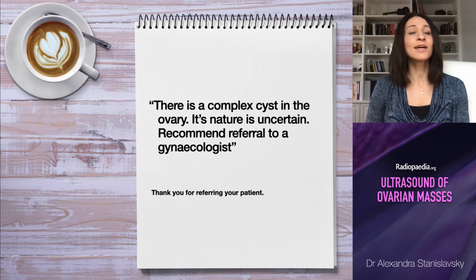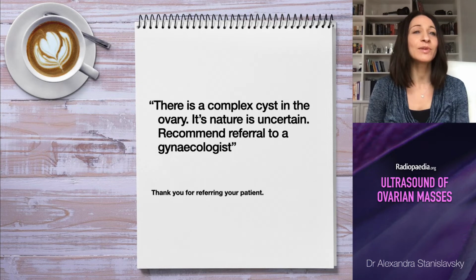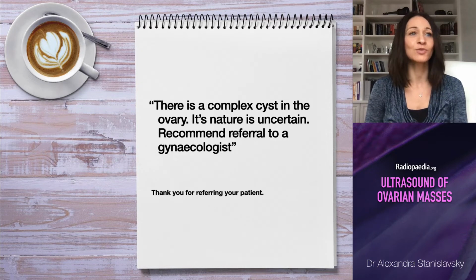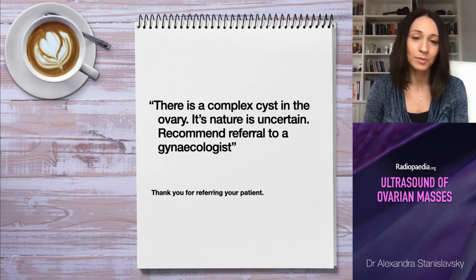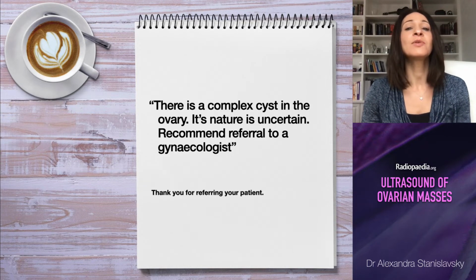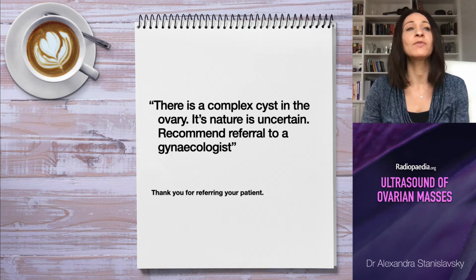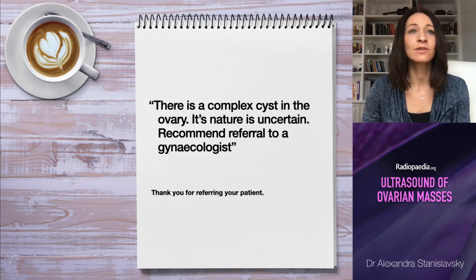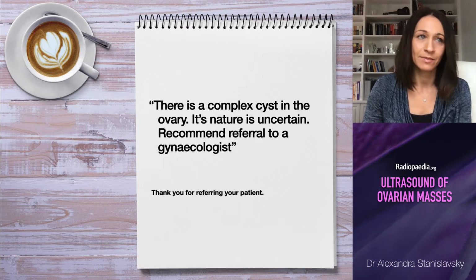So I'm going to start off by being critical. But luckily, I'm not critical of anyone in particular, but of this fictitious report conclusion, which admittedly vaguely represents some of the reports that I have seen and probably written in the past. I'm going to take particular aim at the term complex cyst and suggest that you try to either reduce or eradicate the use of this term from your reporting vocabulary when describing adnexal masses. At the very least, don't use it as an isolated descriptor because it doesn't mean anything.